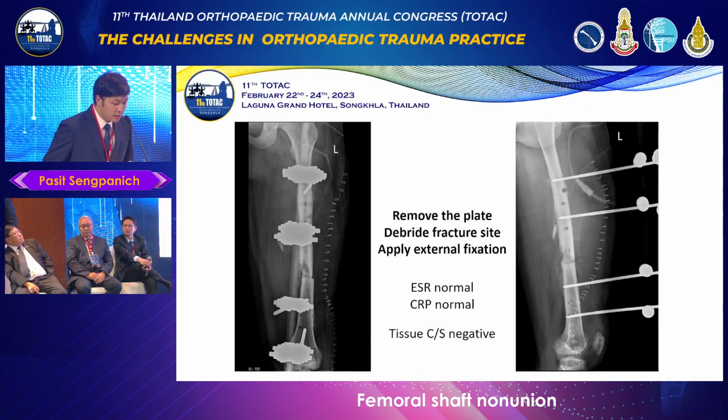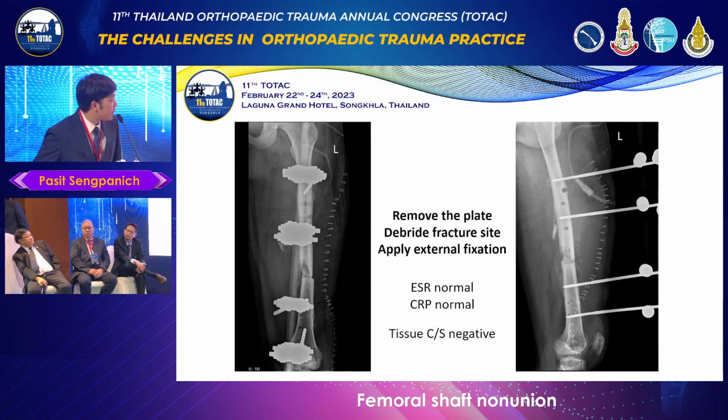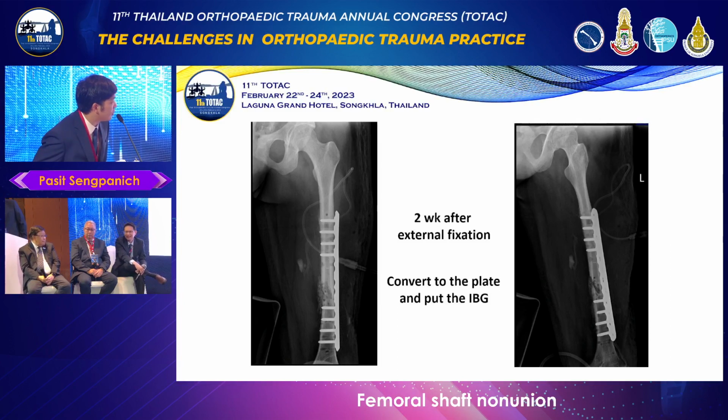So the case, the surgeon restarted everything again: removed all the plates, debrided the fracture site, corrected the tissue, and applied external fixation. The laboratory tests for the septic non-union were normal and the tissue culture was negative. After 2 weeks of external fixation, they converted the external fixation to plate fixation and put in an iliac bone graft. This is the post-operative film.